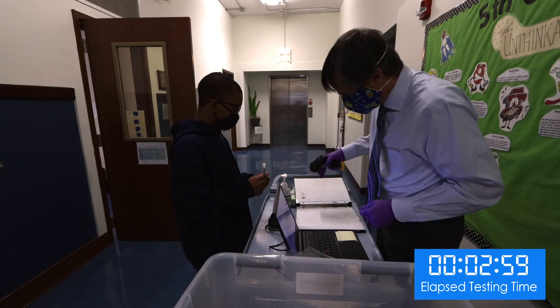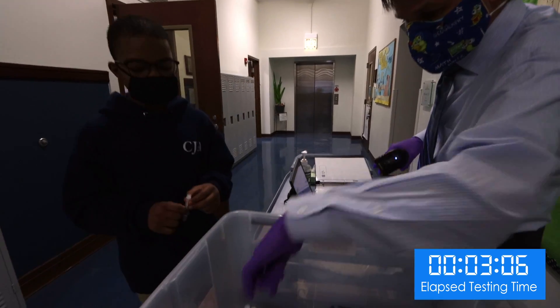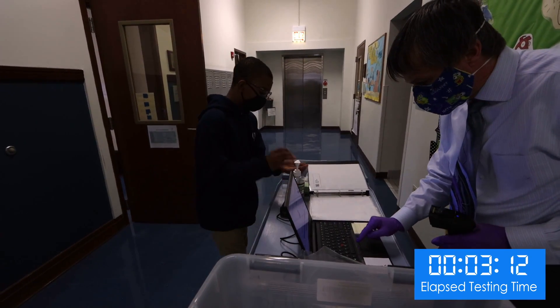The staff member finds the student's QR code in the binder and scans it, then scans the test tube to associate the two. The student places the test tube in a rack inside a collection tub, sanitizes his hands, and returns to his classroom.